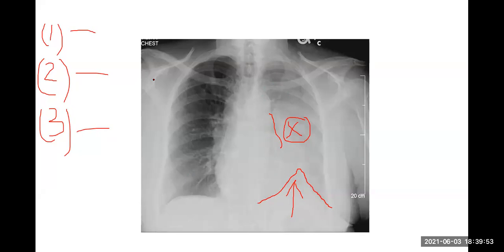Yes, there are a few questions. Lung collapse is not a black lesion, because when the lung collapses it becomes a solid structure. There is no air inside. So Pacer is asking a very important question: shouldn't the trachea be deviated to the same side in lung collapse? Yes, it should. It is not very clear here.